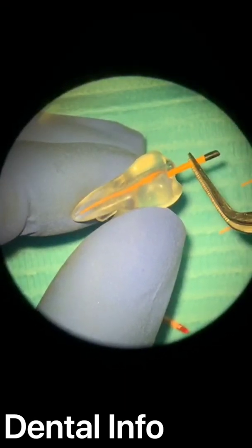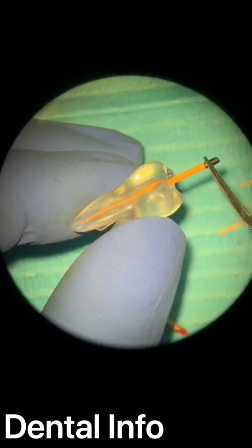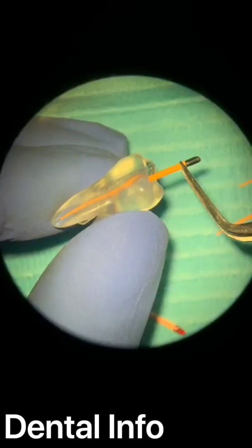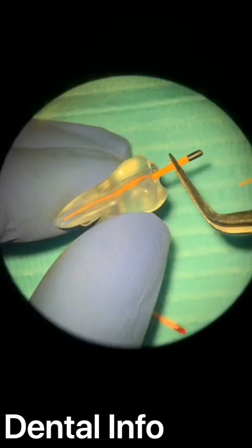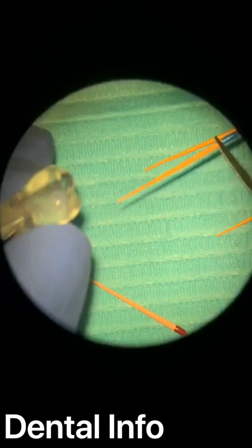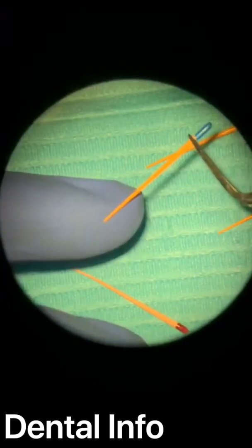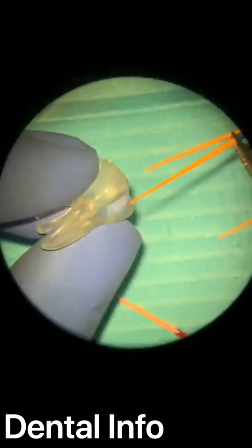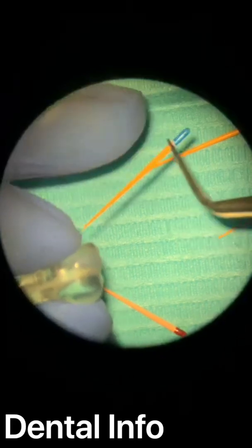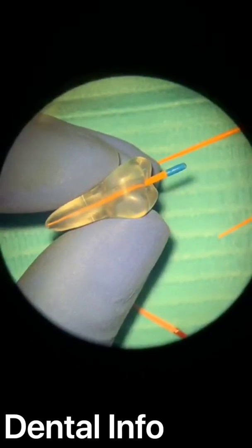See? I have very good tugback, but not every tugback means you are at the apex. So when you are trying different files or different cones, please take your X-ray and be sure where your tugback is, and whether your cone fits or not. So my choice now will be 30 taper 4, even though the canal is prepared to 25, because metal does not match gutta percha cones. Even all the gutta percha cones in the same box are not identical. So always, even if, for example, you drop a cone, please take another cone and try it, because every cone is different. Is everything okay here?